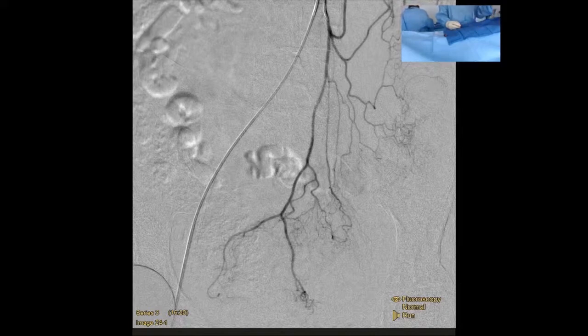The only reason we have this image is really to get our microcatheter down to above that bifurcation. So you use this as a roadmap to get down and do selectives of each of those. You got it. So we're going to work our microcatheter down. We're just getting that set up right now. A TruSelect? A TruSelect, 2.0 French. So a nice, smooth hydrophilic catheter.